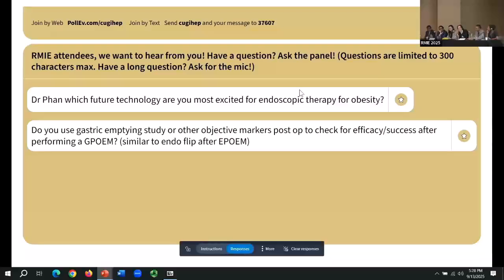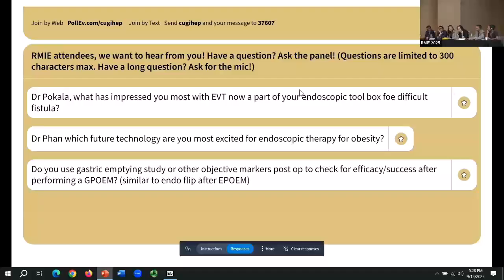My issue is that I've been to Korea many times, or Asia, where I get to see these amazing duodenal stents that are not available in the US. One of the problems is we're using mainly the WallFlex stent. This isn't to pick on that one necessarily. I know there are others. There are a few Korean stents available now, but they don't have all the modifications that I've seen available in Asia, namely that they are really more compliant. They conform to the duodenal C anatomy.